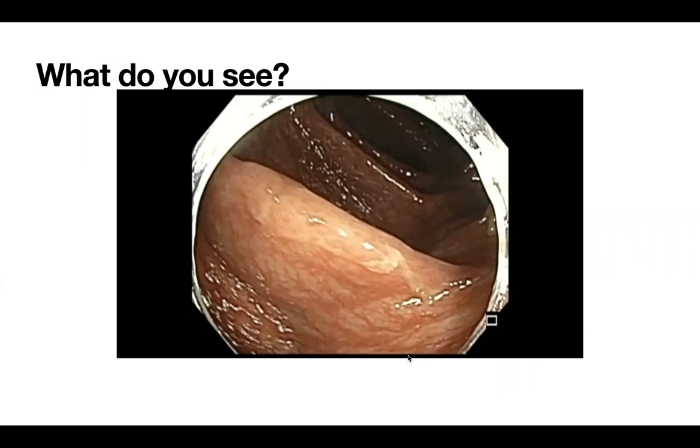And for all my EMRs, I use general anesthesia, routinely as part of a practice. Part of the reason I changed, it's about 5 or 6 years back, we shifted everything to general anesthesia, partly because I was noticing that in some patients, the movement of the right colon and the transverse colon as the procedure went on was quite a bit. And it interfered with the quality of the resection.